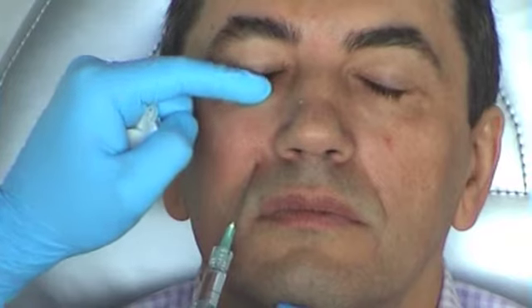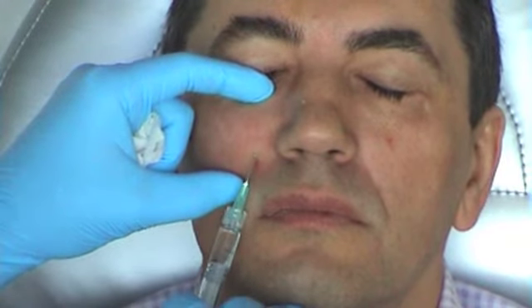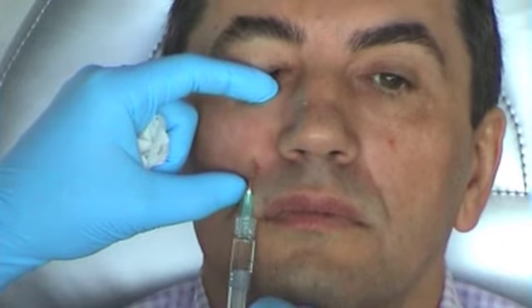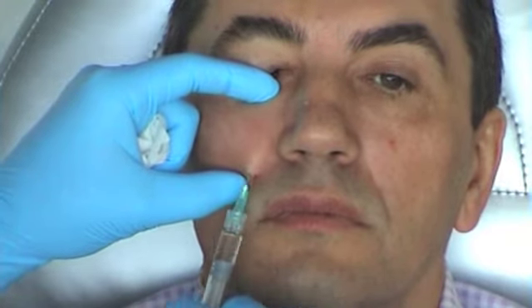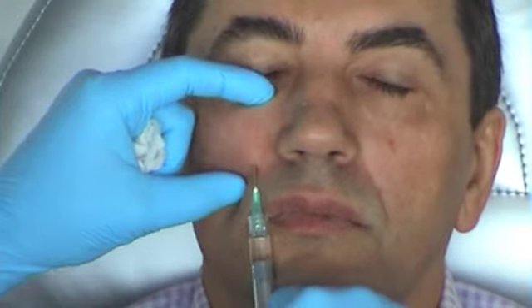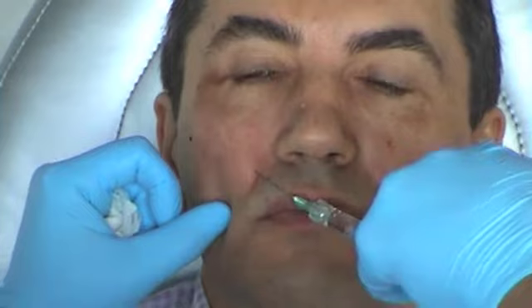Then I use the other local anesthesia I did. The orbital rim is here. So this is for more advanced injectors to go vertical across the tunnels. I feel the bone — because I was on the bone.